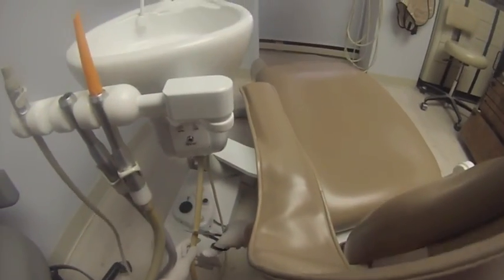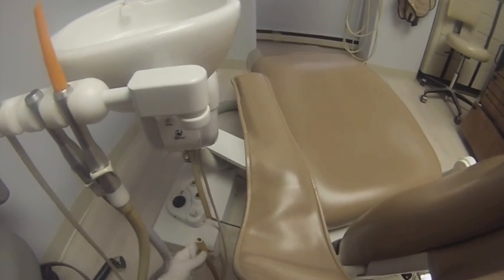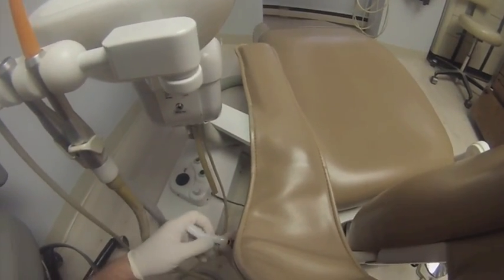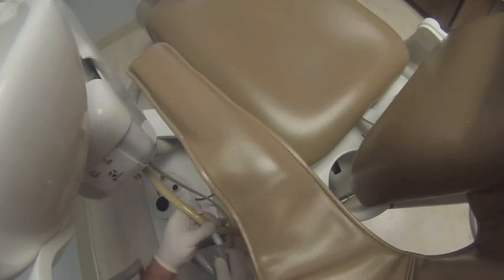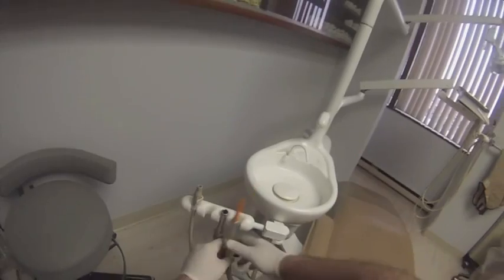Now I've cut the existing hose and have the connection area where I want to splice them together. I'll take the Y part — sometimes you have to heat it up; if you stick it in hot water, you can soften the plastic and stretch it on. I've connected it to my downdraft, softened up the hose to my existing suction tip, and now I'll take my new hose and place it into the Y where it has a barbed connection so it really can't fall off. The suction system pulling material through makes it unlikely to separate, and you don't require clamps.